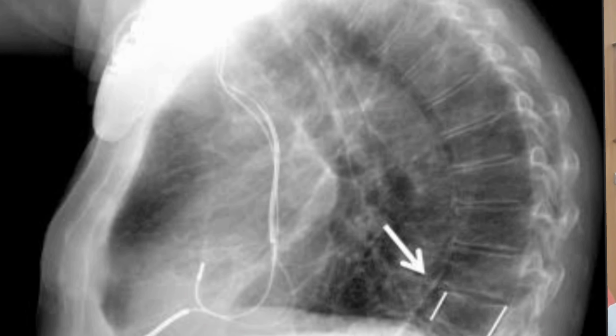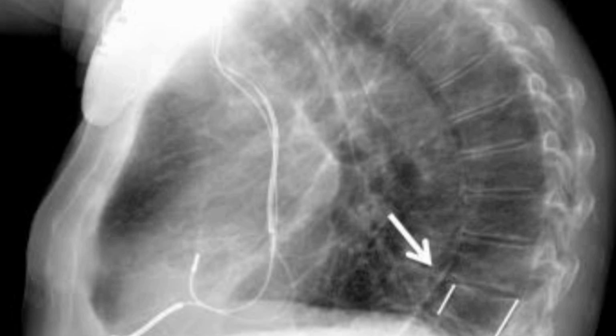Before the gold standard test of bone mineral density, or BMD test, using DEXA scan was discovered, osteoporosis was usually diagnosed by X-ray. In X-rays, osteoporotic bone looks very thinned out, with a weak cortex, and the overall density of the bone, when we compare it with the normal bone, looks somewhat lacking in calcium and density. This was how osteoporosis was diagnosed before BMD tests were discovered.